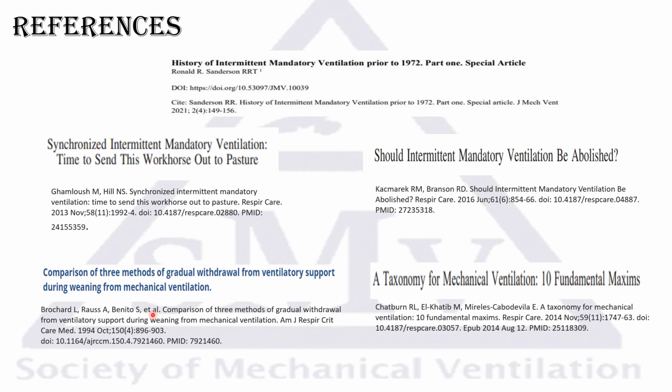Those are the old studies, one of the famous studies by Brochard about comparing three methods of gradual withdrawal of ventilatory support, which showed that IMV delayed weaning. And that's one of the taxonomy of mechanical ventilation that we mentioned in the video.